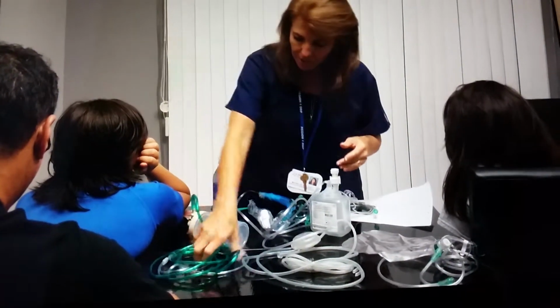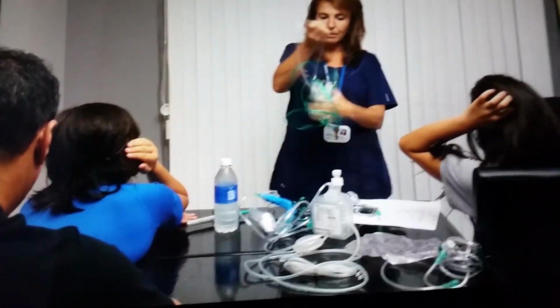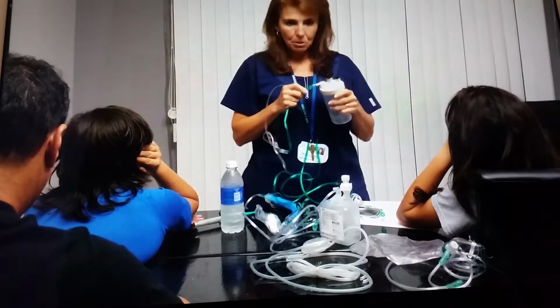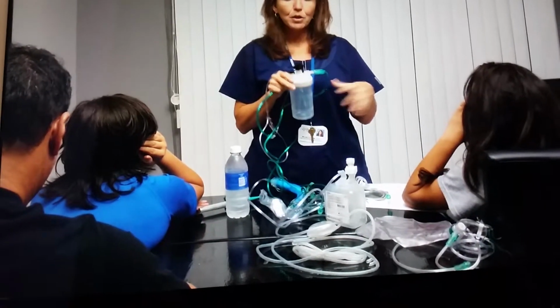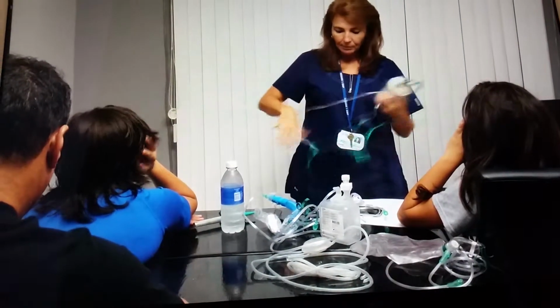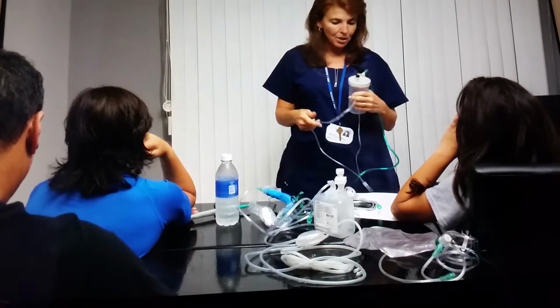So the first high flow system is the high flow nasal cannula, and as you can see, it does look a little different from our basic cannula, and the coloring is green. This type of cannula is always humidified with a special humidifier that has a pop-off valve so it can ensure adequate flow. 6 to 15 liters is the flow for this type of cannula.